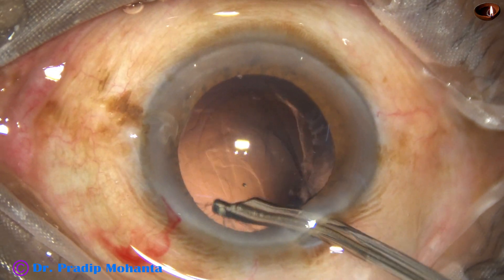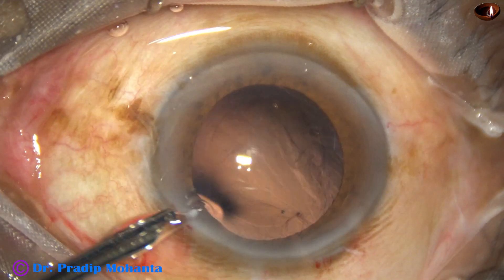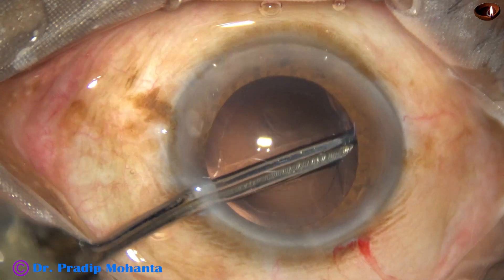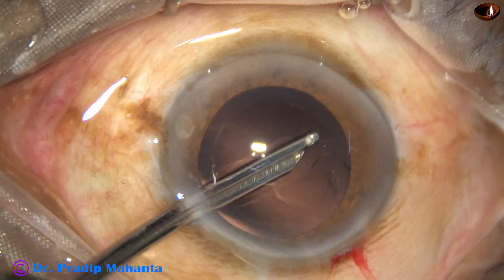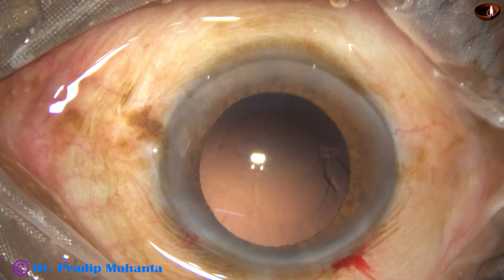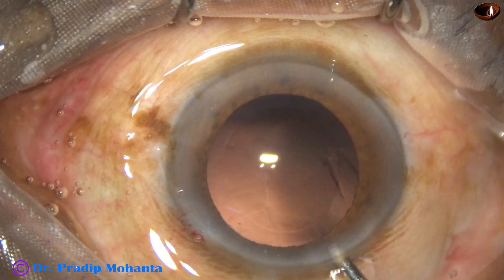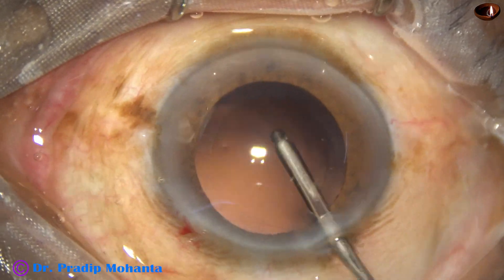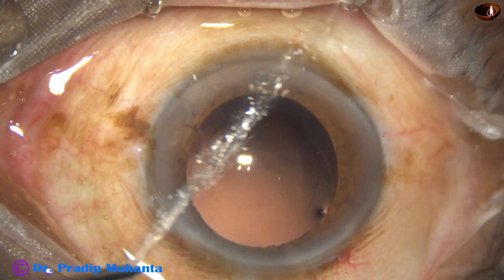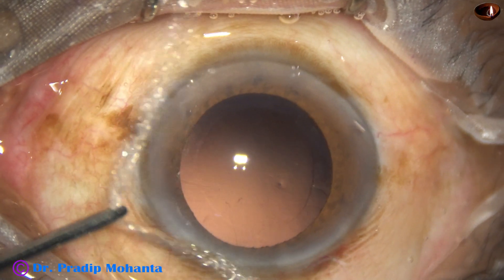A Simcoe cannula is used to remove the cortical lens fibers. Most of the fibers are removed. The posterior capsule is very clean. Now this is polishing of the posterior capsule. The main incision is enlarged a bit because a B cartridge is being used.